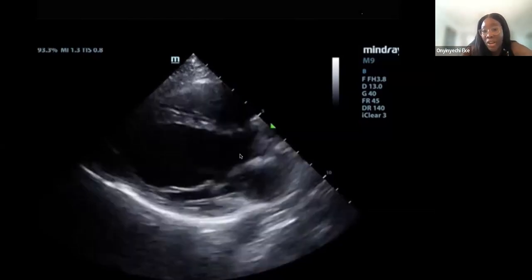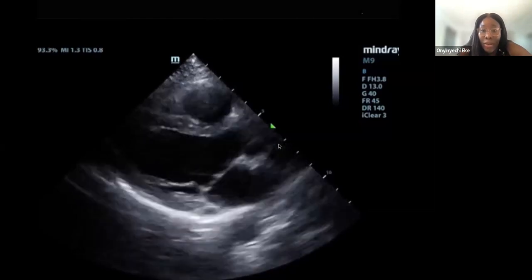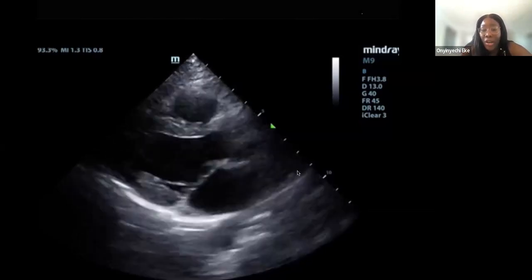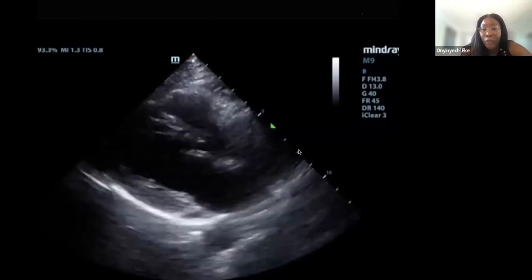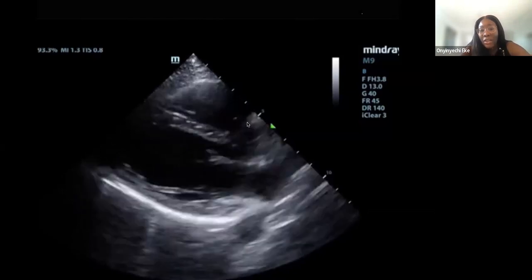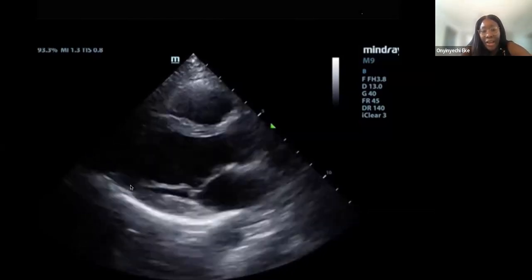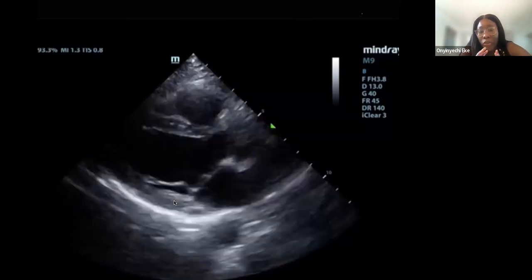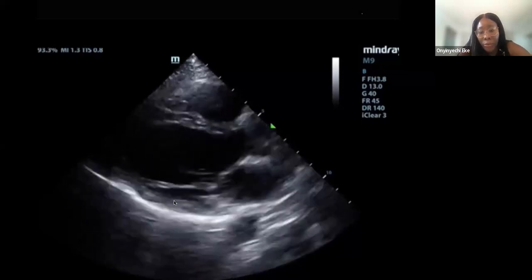If this is bigger here, it can be a sign of aortic aneurysm, or maybe a dilatation caused by some kind of pathology. If the left atrium is bigger, it could be a sign of AFib or left heart failure. So I like to make sure that, for a normal heart, these are the same size and that the LV function looks good. Any questions so far? Please feel free to stop me at any point. And Faith, let me know from the chat.